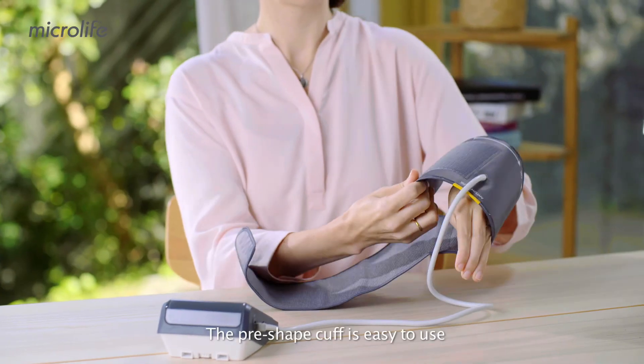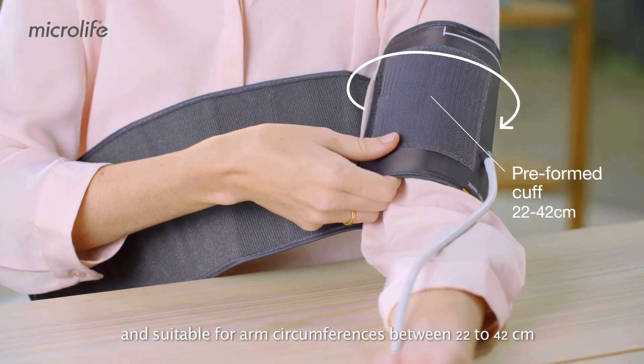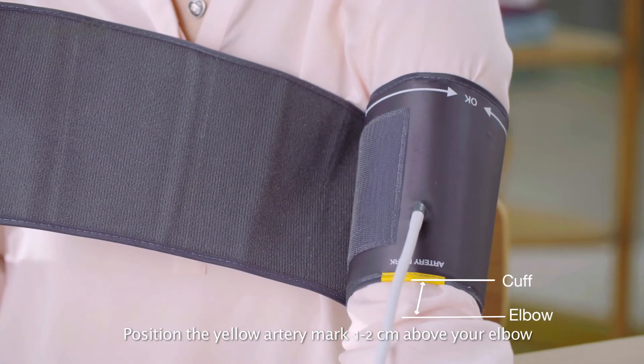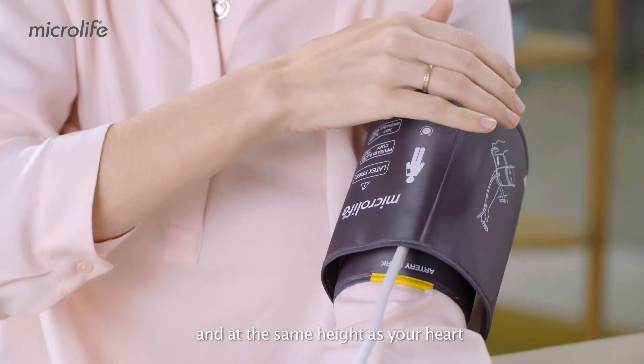The pre-shaped cuff is easy to use and suitable for arm circumferences between 22 to 42 cm. Position the yellow artery mark 1 to 2 cm above your elbow, aligned with the brachial artery and at the same height as your heart.